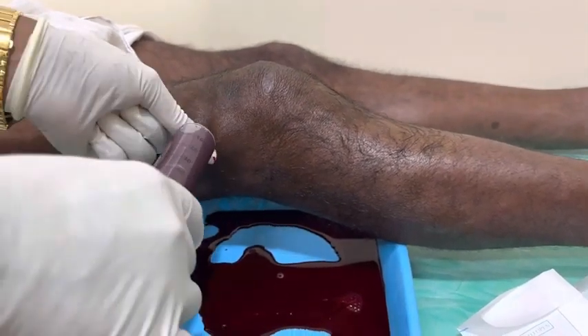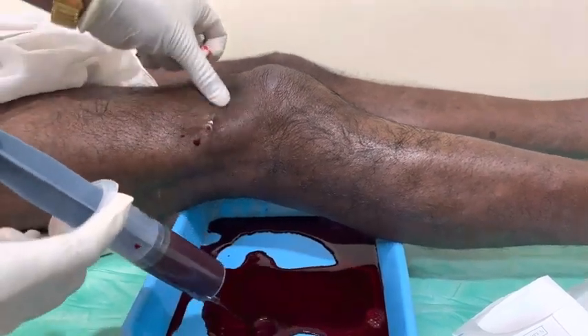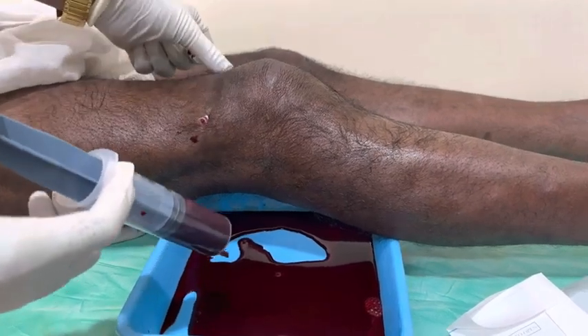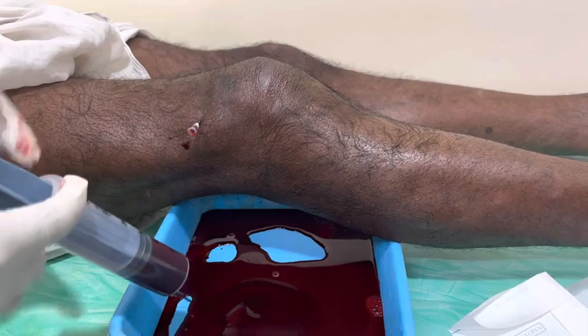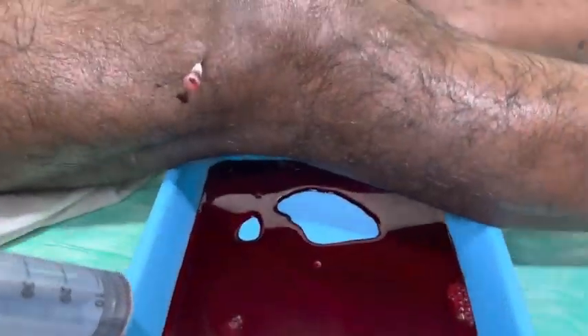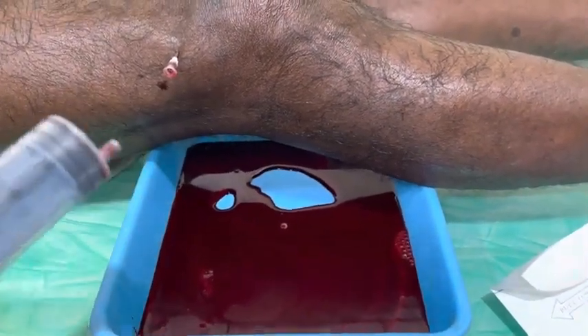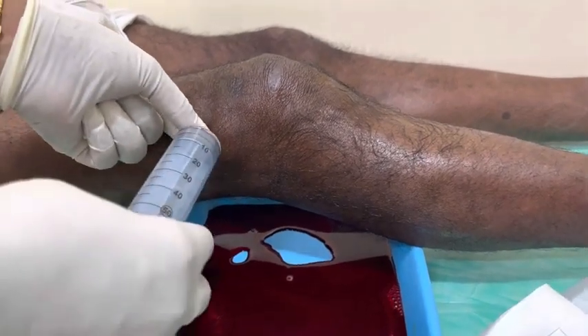Almost 90% of the knee swelling has now decreased — you can see the swelling has gone. In total, I have aspirated around 120 ml of blood from the knee. He will now feel comfortable.